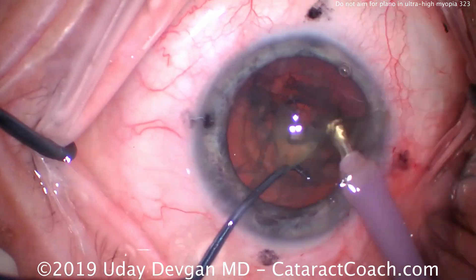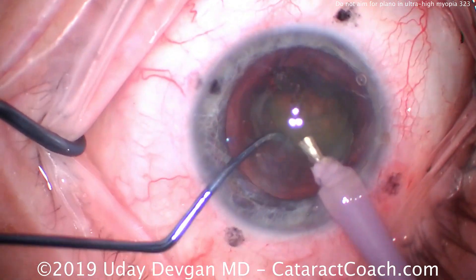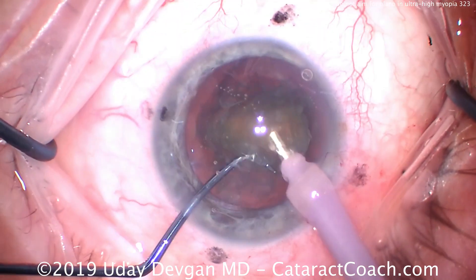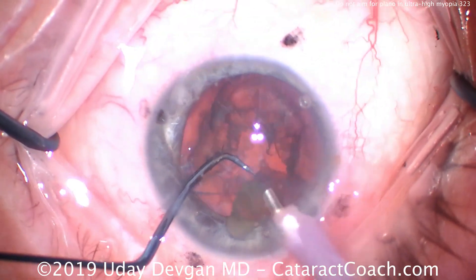It's a very deep anterior chamber, probably 4 millimeters deep — plenty of working room. Getting the other half of the nucleus up and then using FACO power modulations, high vacuum, high flow, and just a bare minimum amount of energy to FACO-aspirate the nucleus.